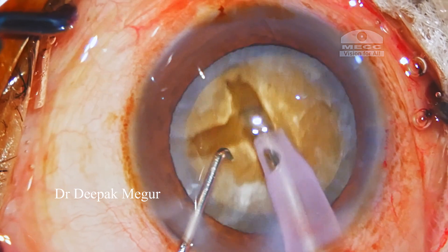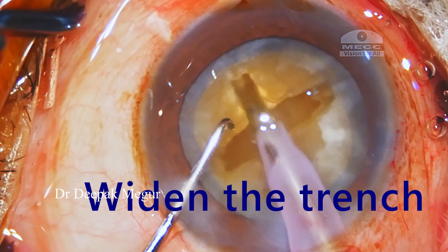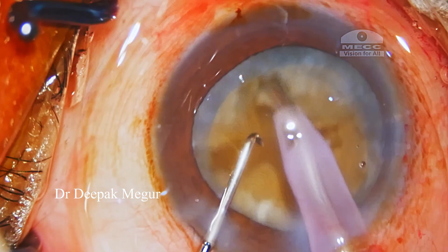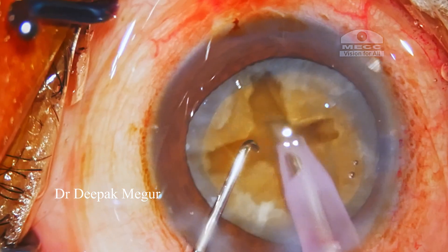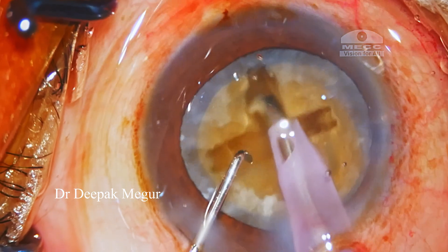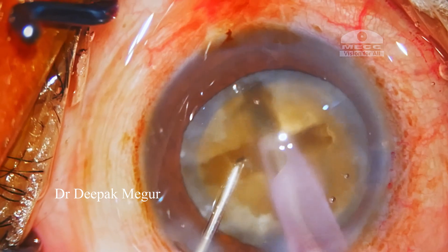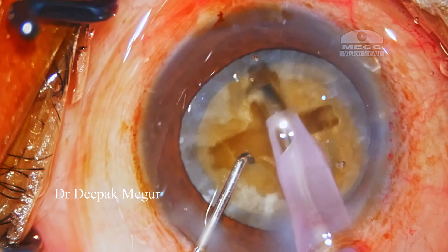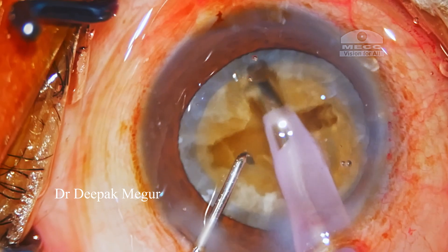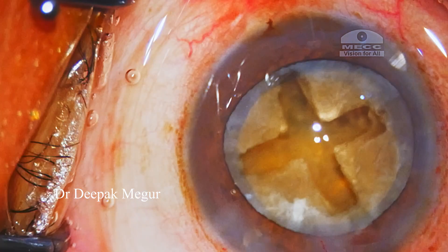The solution is very simple. For the tip to go deeper, the width of the trench has to be wide enough so that there is no obstruction for the tip and the sleeve to travel seamlessly into the nucleus substance, and then we can create a deeper trench. The trick is: a wider trench will ensure deeper passage of the tip and sleeve. We can see the last trench is significantly better because the width is sufficient for free passage of the tip, and the surgeon has also got the hang of the right amount of energy to use for this density of the nucleus.